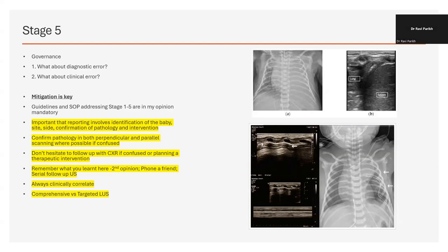It's risk to the baby as opposed to kind of medical legal risk for you. But it might be that you do the chest X-ray and the chest X-ray shows this patch that you've missed in that particular region. And then the question is, your colleagues will start questioning you about doing lung ultrasounds and kind of saying, well, you've done a lung ultrasound. Why haven't you been able to pick it up? It's more sensitive. It's more specific. So then it results in a group of people who then tend to disbelieve your skills and kind of think that you're a cowboy who's using lung ultrasound in your unit on your own without the actual skill. And that's where you have to be careful because credibility becomes quite important when you're trying to implement it.